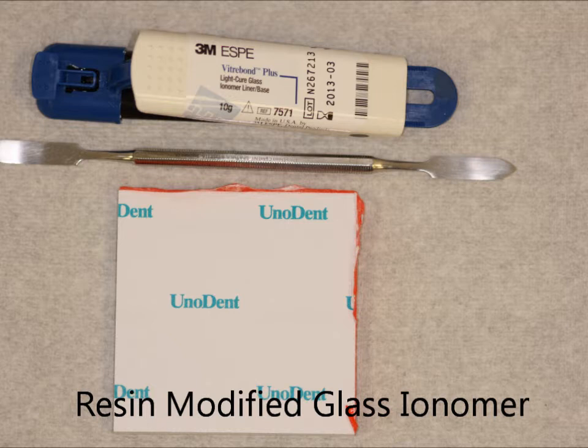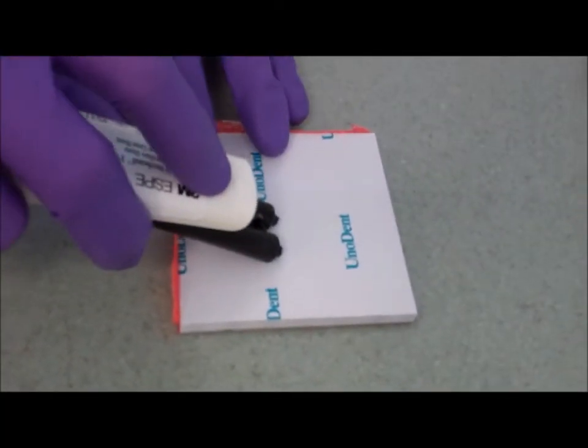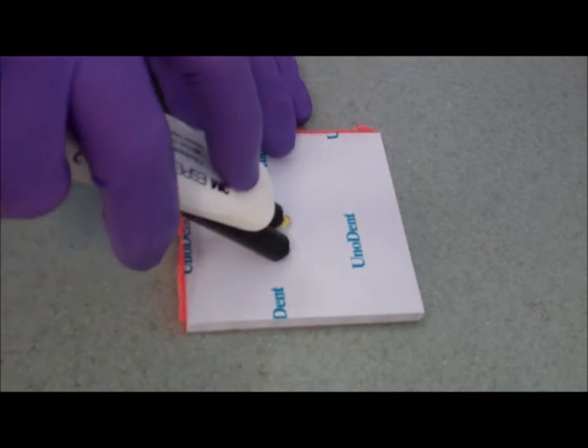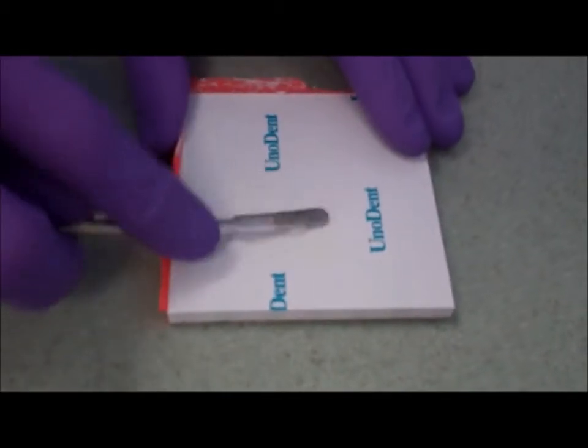Resin modified glass ionomer, this one in particular is used for lining materials. It comes in a cartridge. If you press the lever you'll get two equal amounts of liquids, one is an opaque white color, one is clear, and you just mix these together until you have an even color.